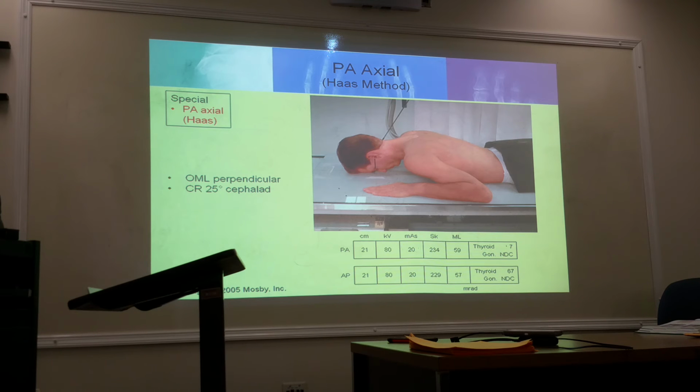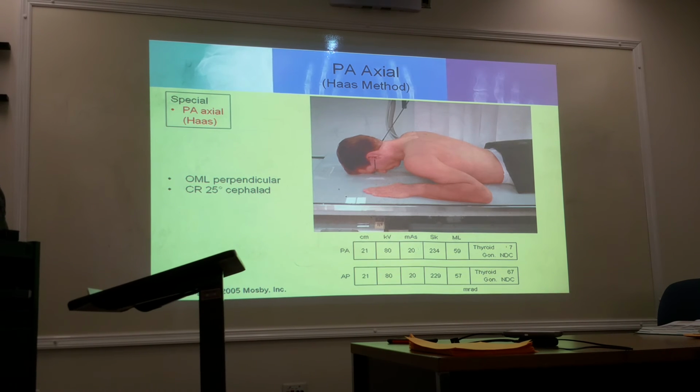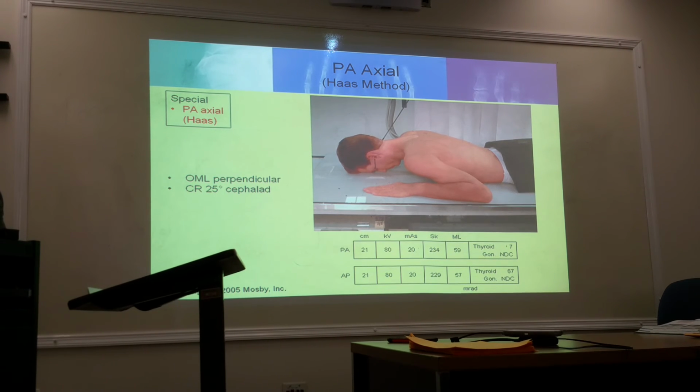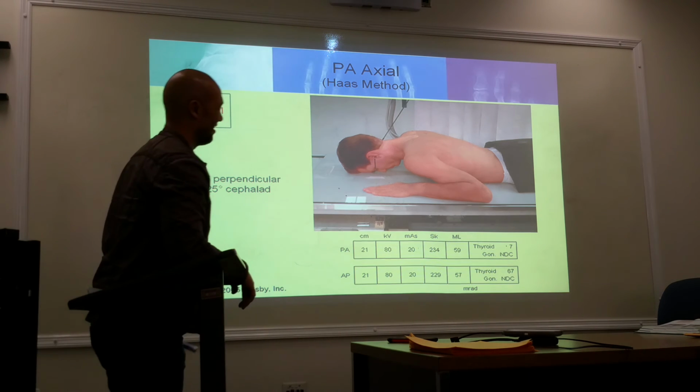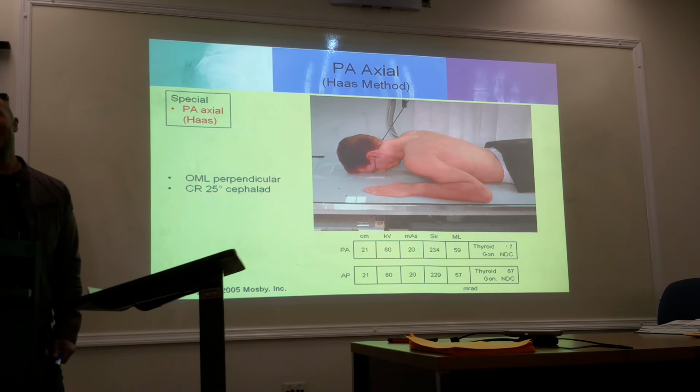I was thinking about the shape. People have different head shapes. So if someone has a very oval shape, what are you going to do? How can you angle it? You just do the best you can, but again, we're using the baselines to do that.